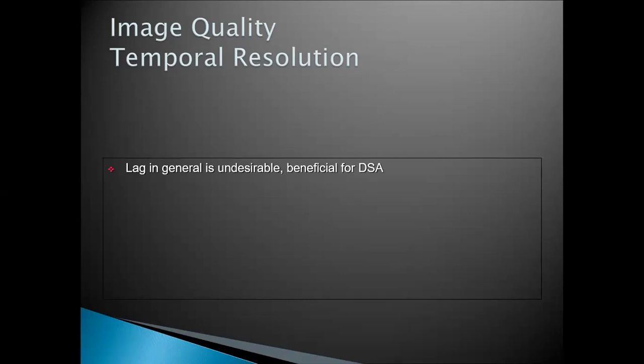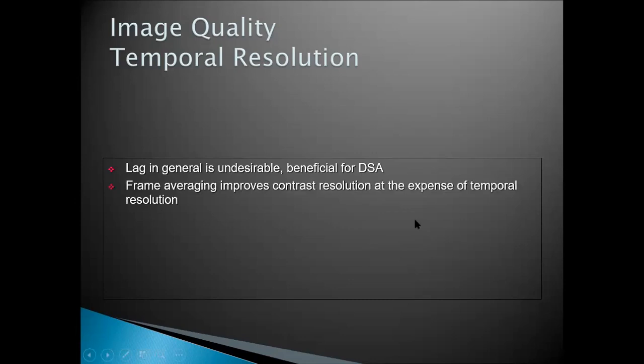We continue to see the image of the previous frame, part of it, in the next frame. So it is not a problem for DSA, but in every other thing, it's not a good way.